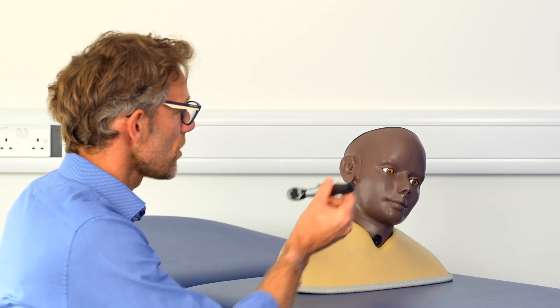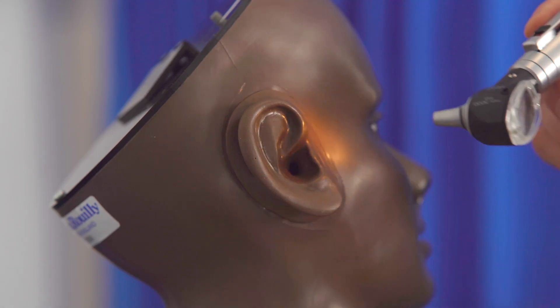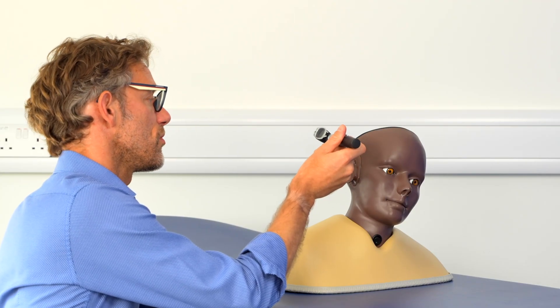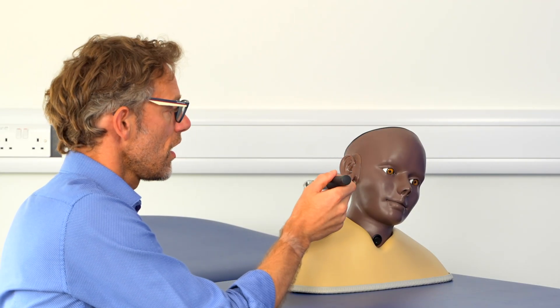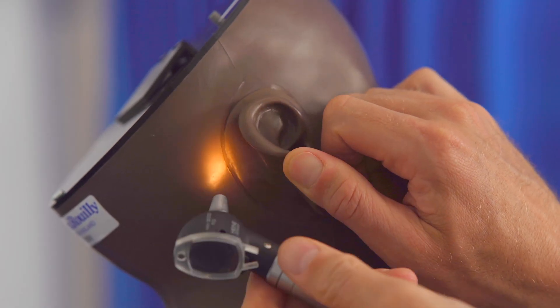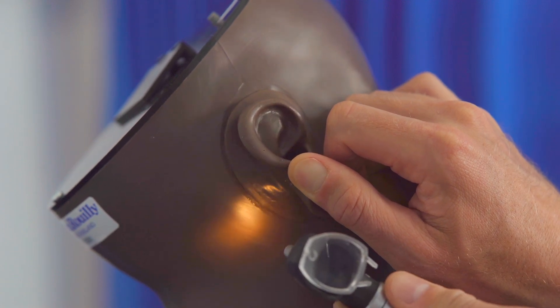Having a look around the ear from the outside, I can't see any evidence of scarring, there's no bleeding, I can't see any changes to the skin, so BCCs or SCCs. Looking behind the ear, moving the ear forwards, there's no evidence of inflammation to the mastoid, nor can I see any surgery issues.